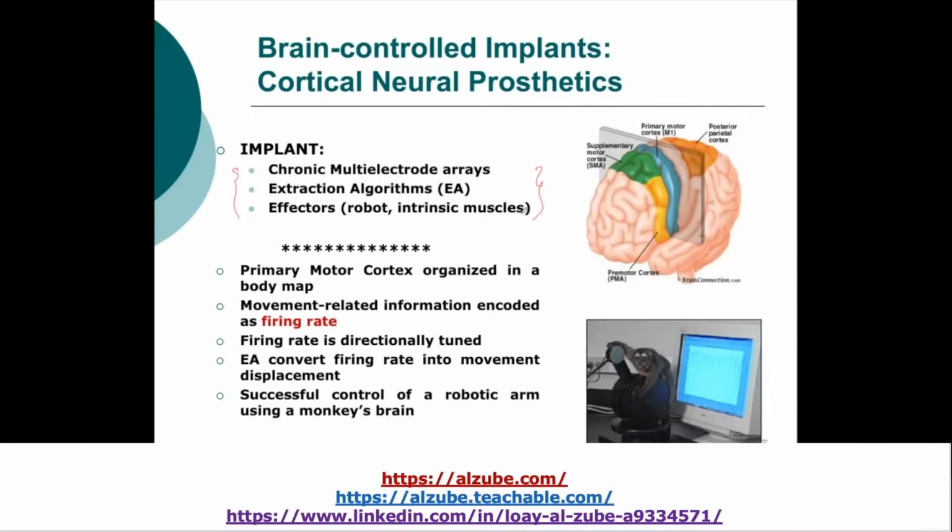So for biomedical engineers, if you are interested in electrodes, everybody is investing time, energy and money in developing arrays of microelectrodes. We're going to discuss electrodes in more detail. We'll talk about the classical types of electrodes and typical types of electrodes. But now those are multi-electrode arrays, and they are small electrodes. We are even working at the nanoscale on developing these microelectrodes and multi-electrode arrays.